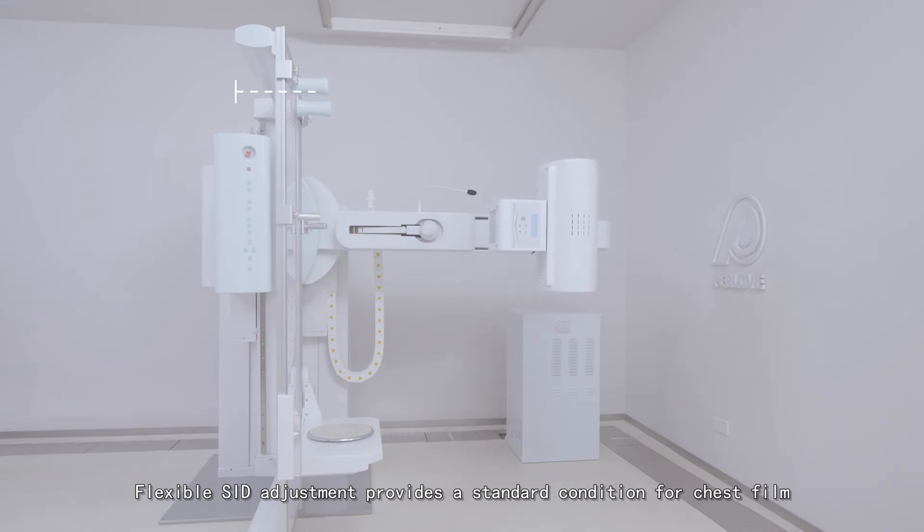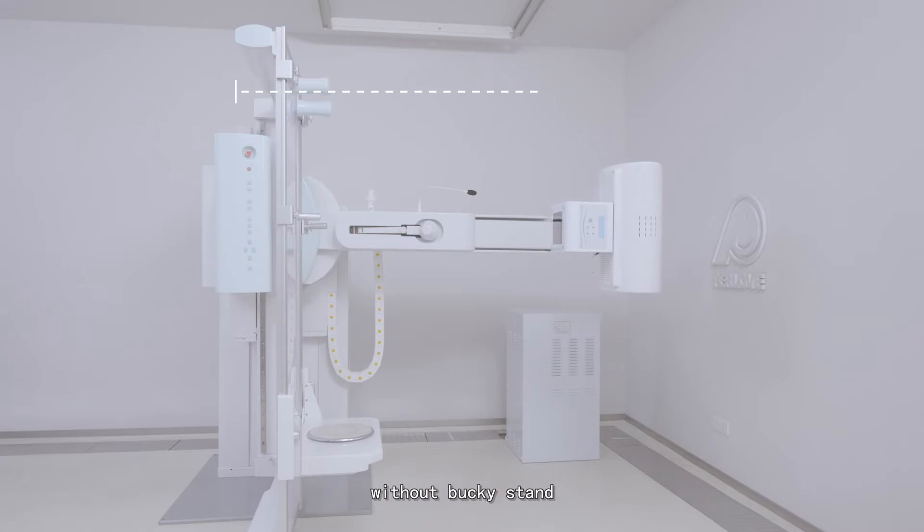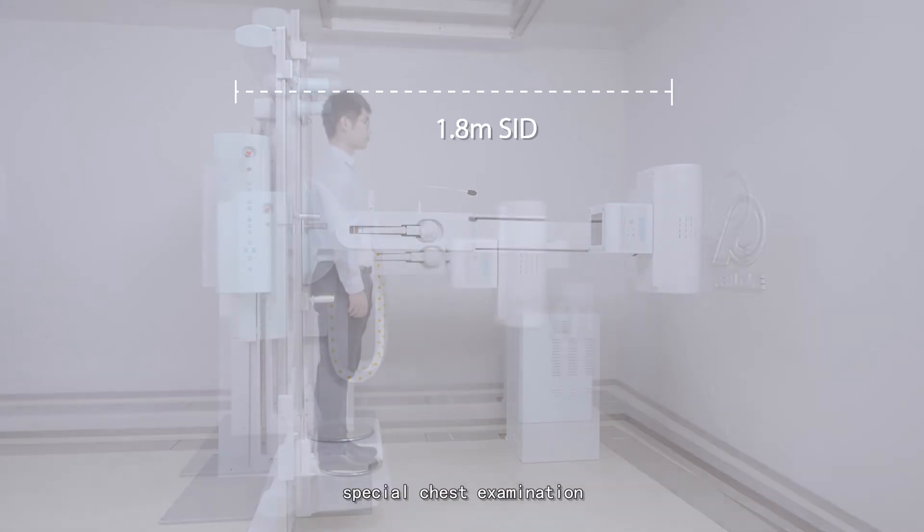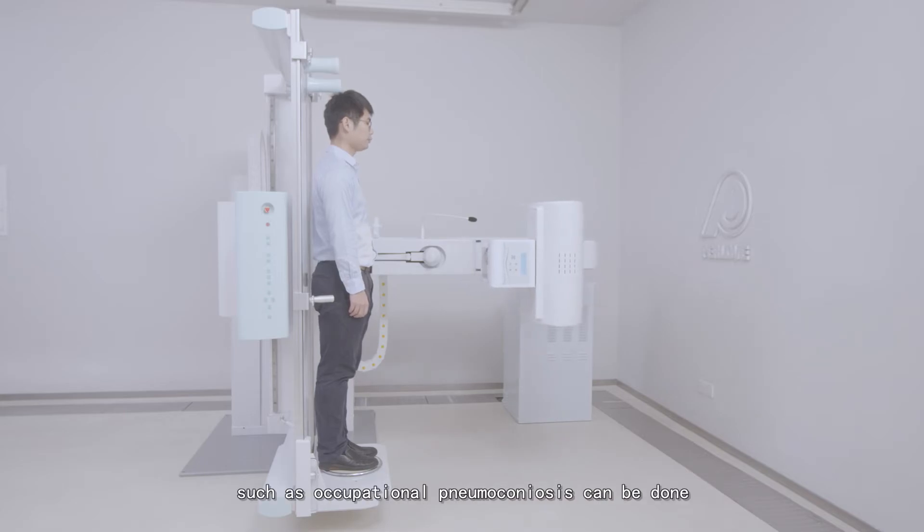Flexible SID adjustment provides a standard condition for chest film. Without bucky stand, accompanied by high-kilovolt radiography, special chest examinations, such as occupational pneumoconiosis, can be done.